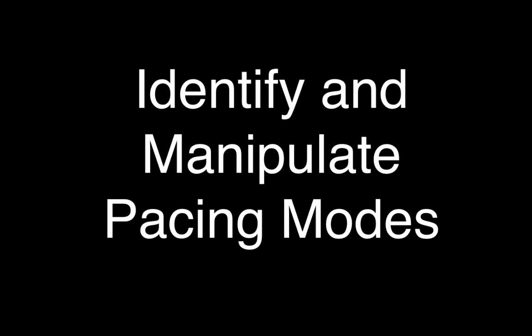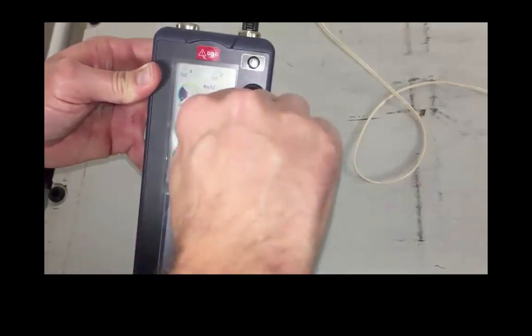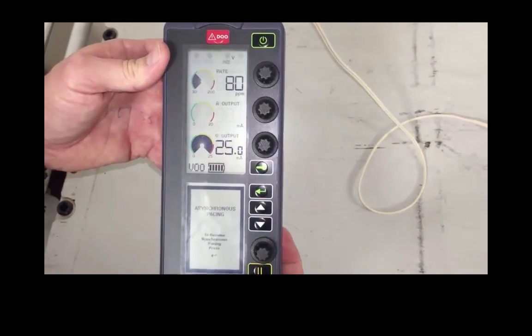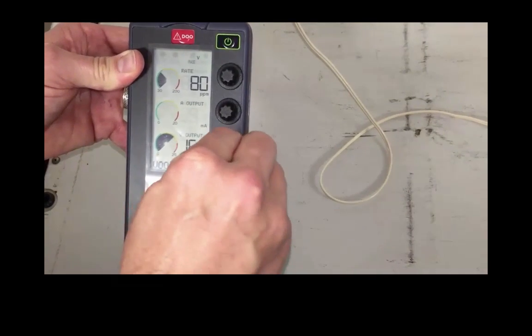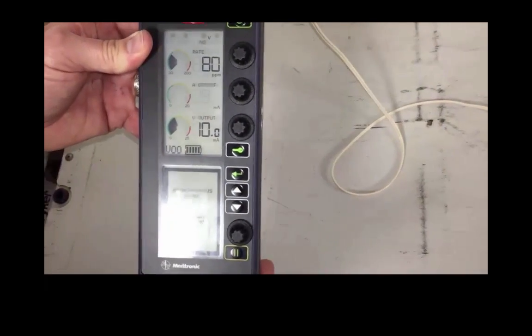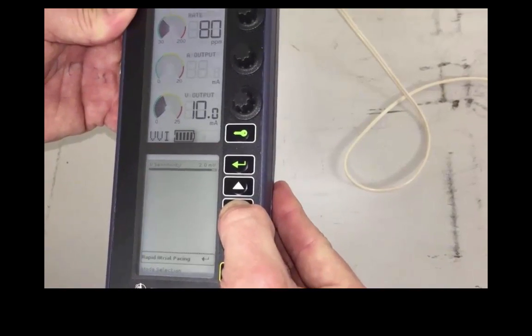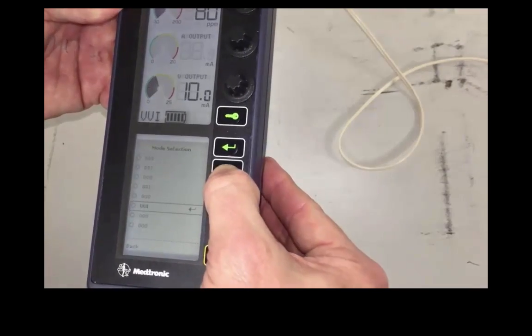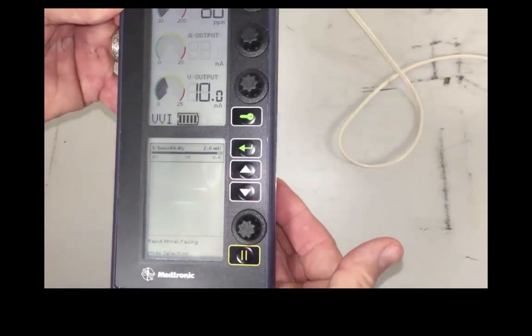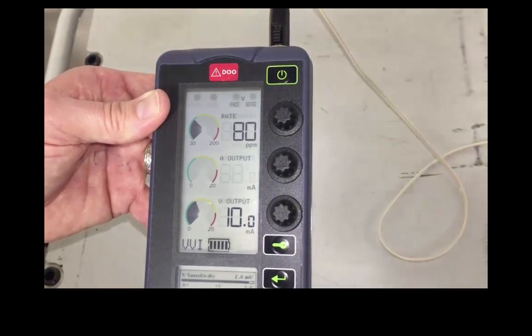In order to identify and change modes of pacing, it's important to understand where to find the mode of pacing that you are in, and a couple of different ways in which you can change the mode. The mode is always going to be in the upper screen in the lower left-hand corner. In this instance, Dave has changed the mode from a DOO, dual chamber, to a VOO, single chamber, simply by taking the atrial output to zero. The other way to manipulate the modes is on the lower screen where you can go to the menu and select which mode of pacing that you want to be in. In order to do this, it is important to understand the three-letter identifiers associated with pacing that were discussed earlier in order to utilize temporary pacing to your advantage.